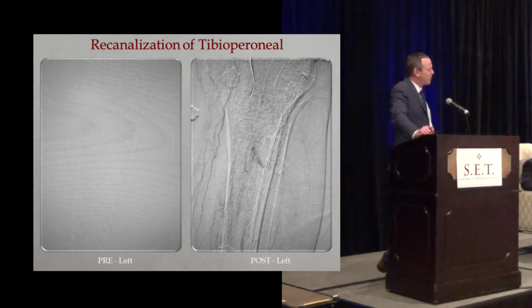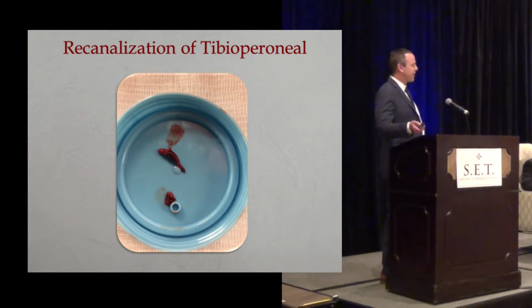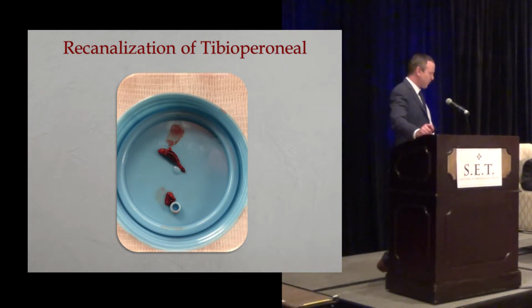She was of somewhat advanced age, 82, but we were able to cap that lesion and take it out. This is the clot itself as we take it out. We just want to go down there where we think the clot is, then turn on the machine. What you really want to see is actually no blood coming through the catheter. If you see blood coming through the catheter when you're taking out a big clot, it's probably not doing its job, and you probably need to advance it a little bit more. Most people get very excited when there's a lot of blood coming through, and they think that the system's not working when there's nothing coming through.